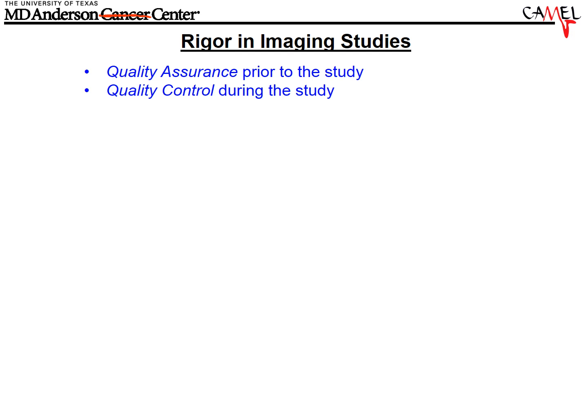Finally, I just have a series of topics without any graphics. I know that's not the most compelling thing to see during a webinar, but these don't really lend themselves to graphics very well. I'd like to say just a few words about rigor in imaging studies. Of course, we like to say that we ensure our techniques work well before we start a study. We have good quality assurance. We know that an MR machine produces a relatively linear image along all three dimensions, so we can measure tumor volume relatively accurately, right? That's good assurance.